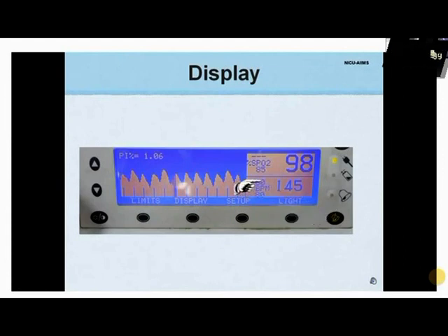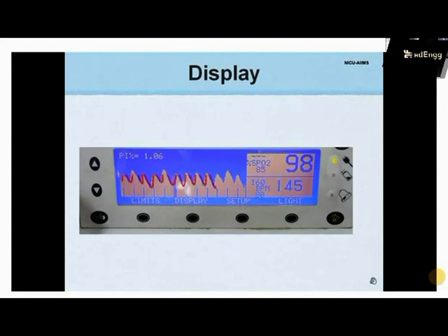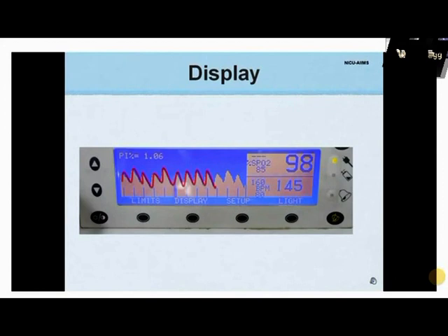Note the pulse rate display, and this shows the oxygen saturation of hemoglobin. Both panels show the limits set by the operator. This is the plethysmographic waveform, which automatically scales to the perfusion level or strength of the signal being received at the monitoring site.